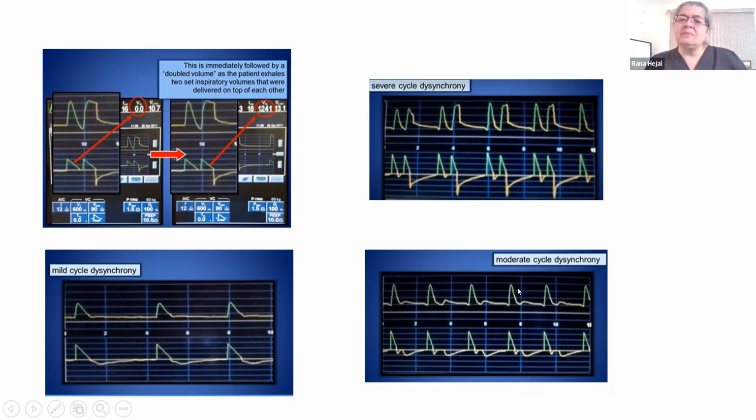And more importantly, they may end up further injuring the lung, and when you're trying to support their ARDS, it might get worse. Now, I have to admit, if I see something like this, I will miss it. The only thing that would seem odd to me is, my God, this expiratory phase is so small. In principle, the area under the curve during inspiration and during expiration should be equal. But in here, it is not.